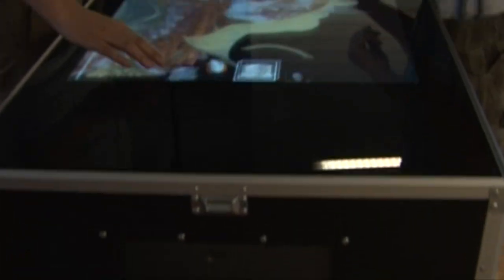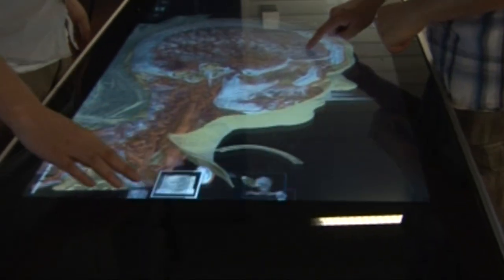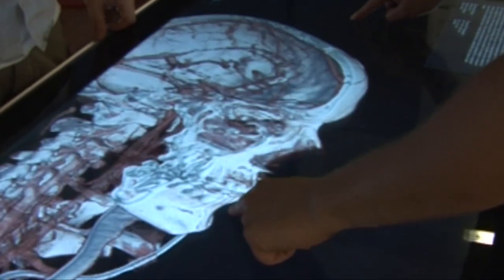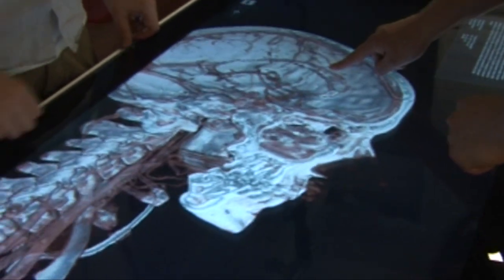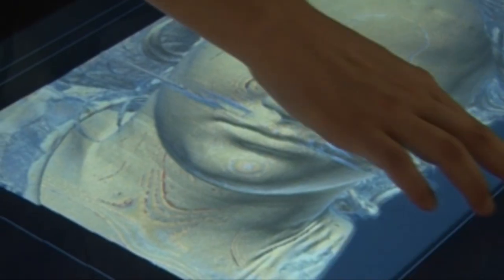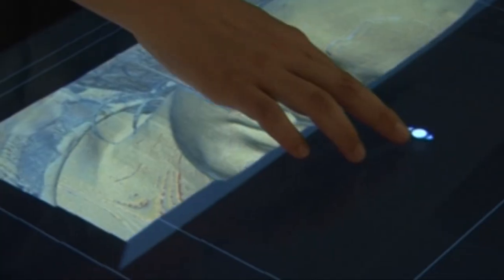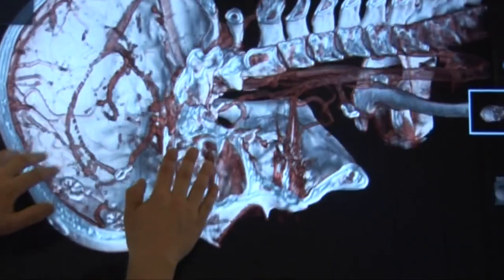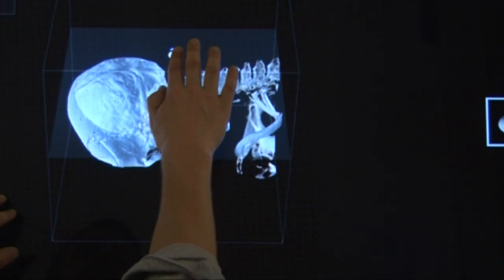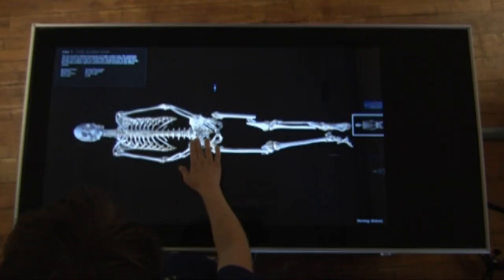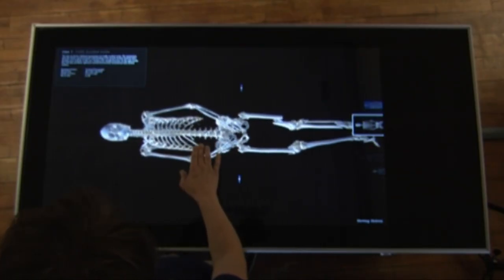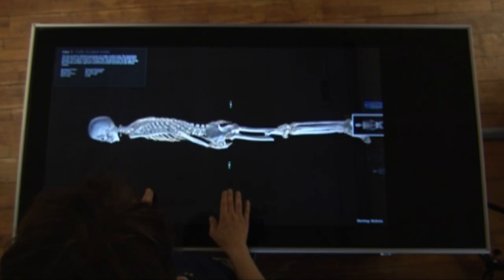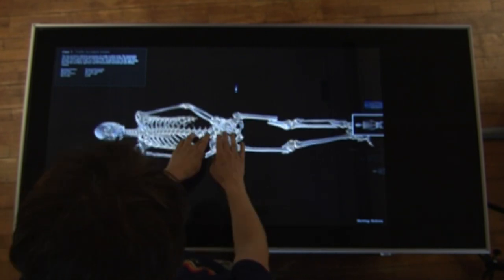This is a short presentation video of the Virtual Autopsy Table, an interactive installation based on cutting-edge research within medical visualisation. In this installation, with the help of an easy-to-use multi-touch surface, the user can interact with stunning volumetric 3D datasets of real scanned bodies.